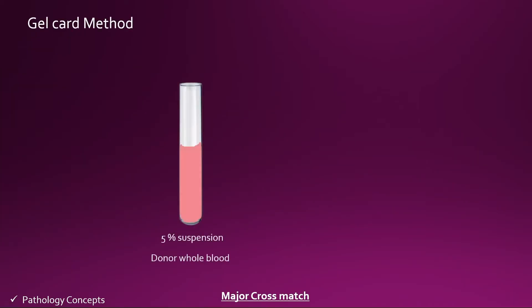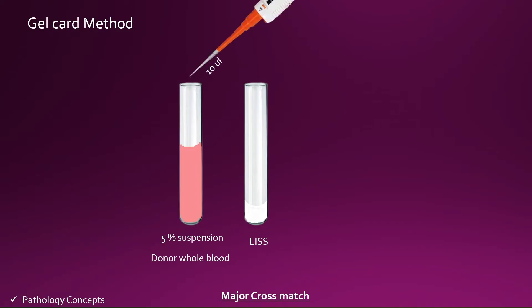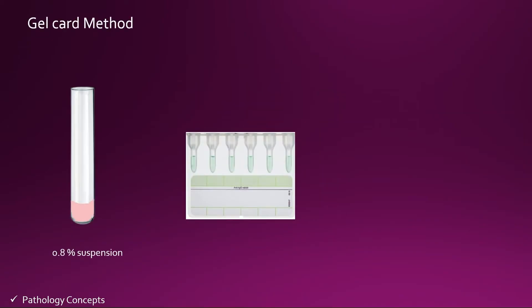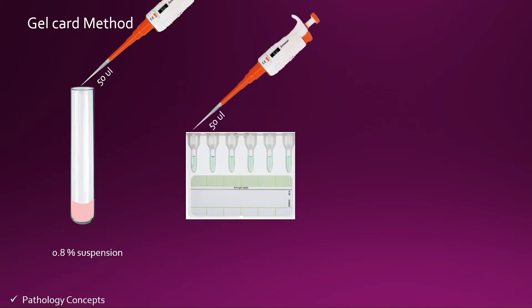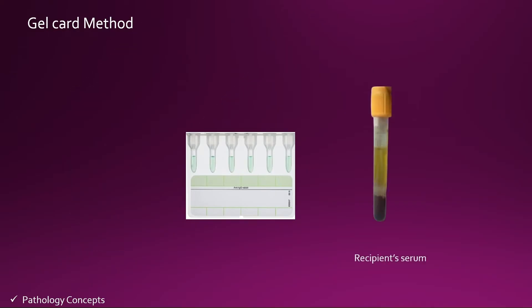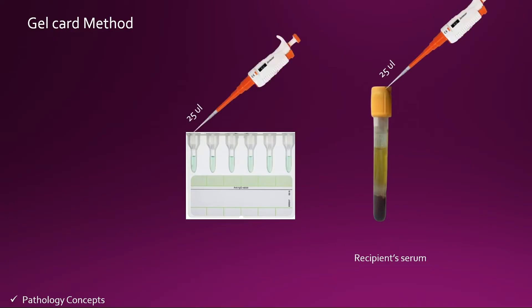Now let's learn the gel card method. First, take the 5% suspension of donor whole blood. Take 1 mL liss in another test tube. Add 10 microliters of 5% suspension from the donor whole blood to the liss test tube and make a 0.8% suspension. From this 0.8% suspension, add 50 microliters of RBCs into the gel card column. Now take the recipient serum, add 25 microliters of recipient serum into the same gel card column, incubate at 37 degrees for 15 minutes, and after 15 minutes centrifuge the gel card and read for reactions.